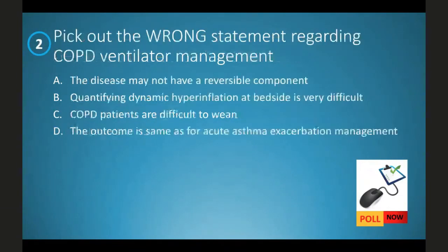Proceeding to the second question: pick out the wrong statement regarding COPD ventilator management. Option A, the disease may not have a reversible component. Option B, quantifying dynamic hyperinflation at bedside is very difficult. Option C, COPD patients are difficult to wean. Option D, the outcome is the same as for acute asthma exacerbation management.